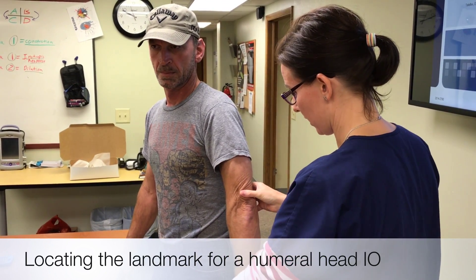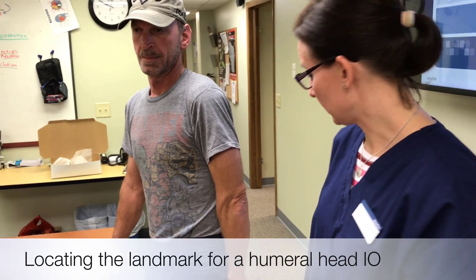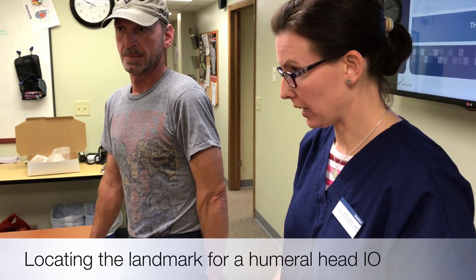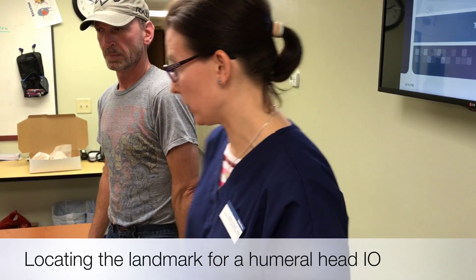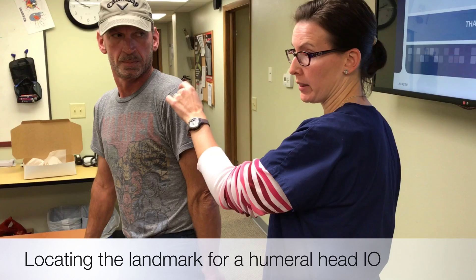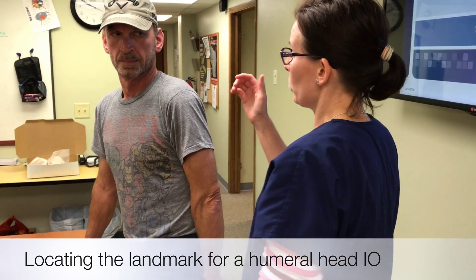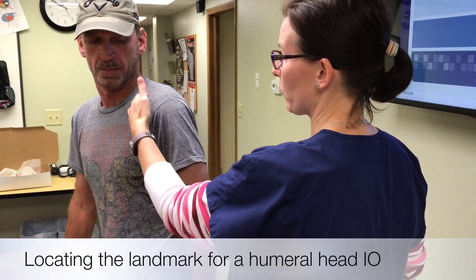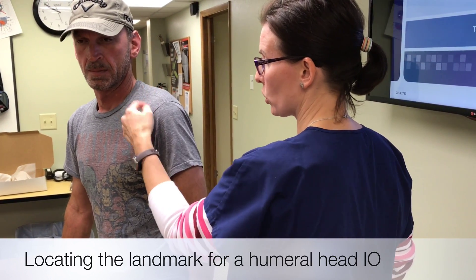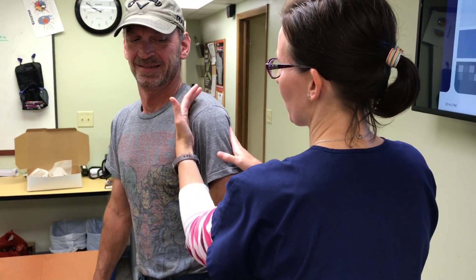My preferred way is to rotate the whole arm in — not just the hand — and put the back of the hand toward the thigh. If they're lying down, you can hold it with your knee or do a hip check. This is only important during insertion; their arm can go back to resting afterward. Now find your first landmark: place the ulnar aspect of your hand in the crease at the shoulder. That moves the biceps tendon out of the way so you don't insert there.